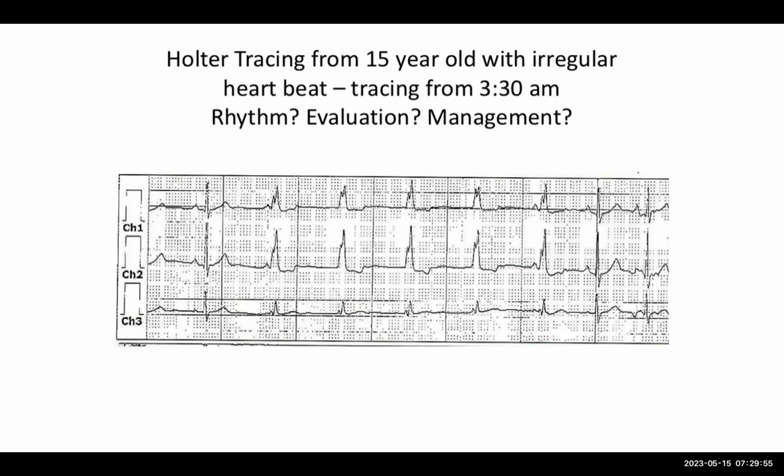Okay. I would say it's not as concerning, given that it's during sleep and the heart is doing, as you mentioned, whatever's fastest wins out. And so when the sinus node is slowing, you have these cells with inherent ability elsewhere in the body to pace or to set the rate above that. So I don't think I would do anything, pending, like you said, there were no other abnormalities. Yeah, I would agree with that. We do see this occasionally. It's a little unusual. We don't often see ventricular rhythms like this.